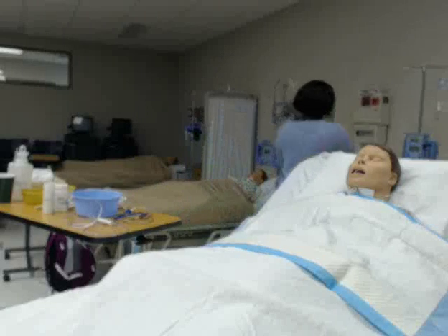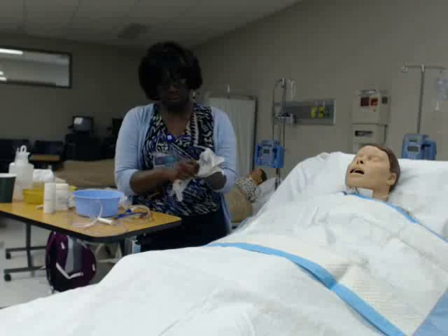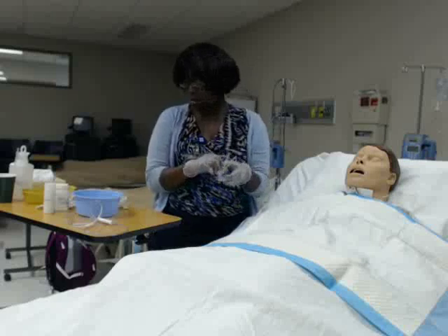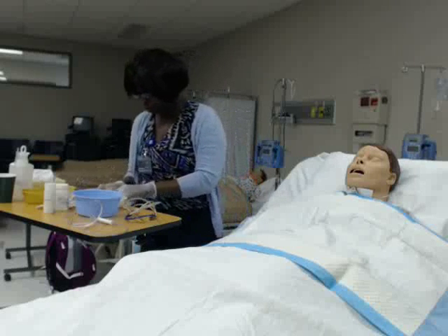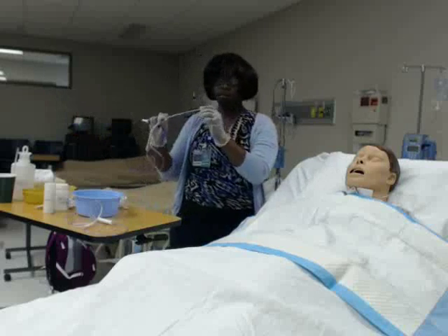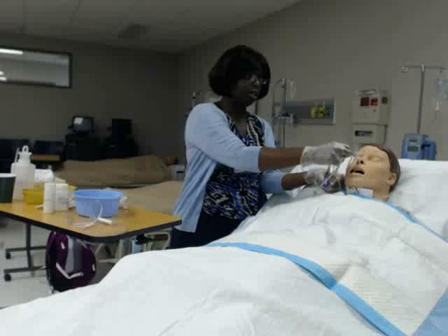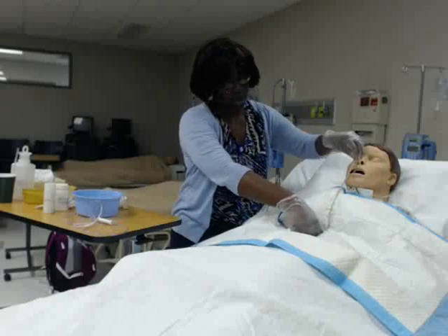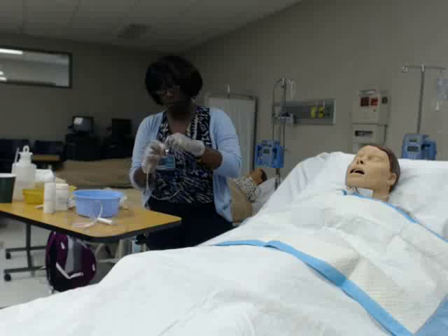I'll put on my clean gloves. I need to measure how far to go down — I should have prepared a piece of tape to mark my spot. To measure: take the tip of the tubing, start at the end of the ear, go to the tip of the nose — that's your first measurement. Then go from the tip of the nose down to the xiphoid process. Feel for that spot, mark it with a piece of tape, and that's where we stop inserting. We don't want to go further than that.